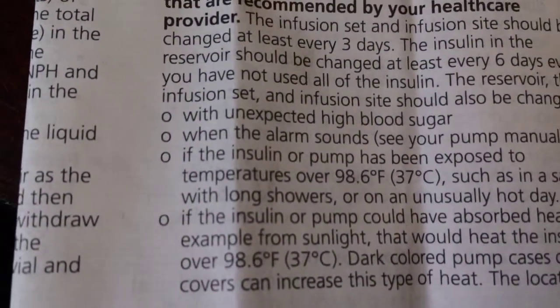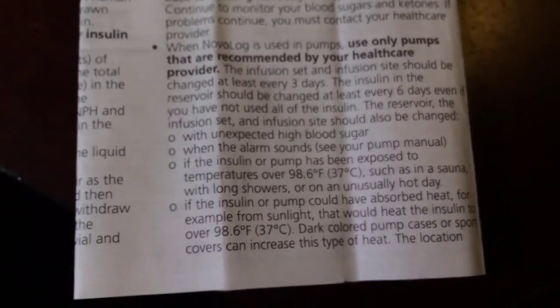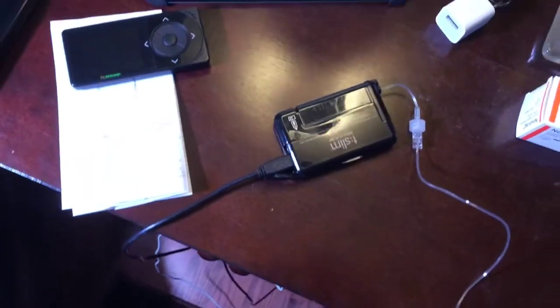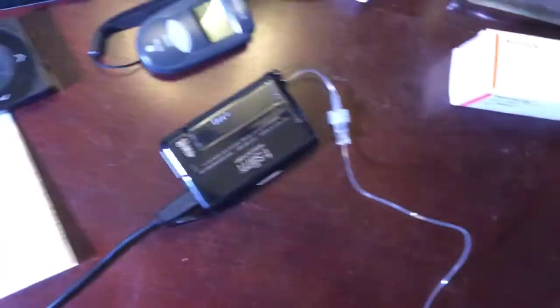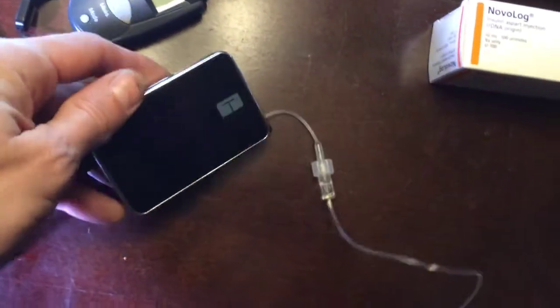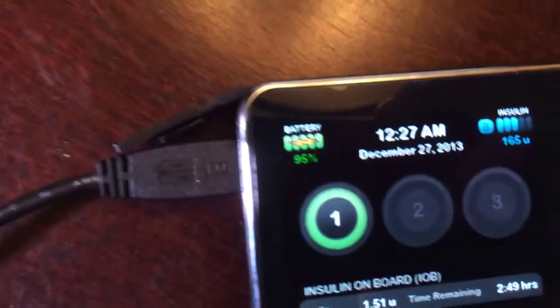That pretty much answers it. 45 minutes of charging the pump, with the cable designated for it and the charger that came with it — a 1-amp charger — and not once did we reach over the 98.6°F maximum that Novolog is capable of handling. By the way, I have done this before: I actually had the pump in my pocket while it was charging, and it still never reached over 98.6. Even if the battery gets a little warm, even if you charge it more than a daily top-off when you let the battery go down to 30%, you're still charging at 95% — not going to reach over 98.6.